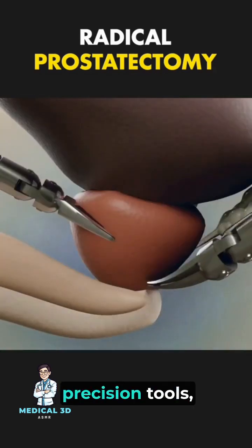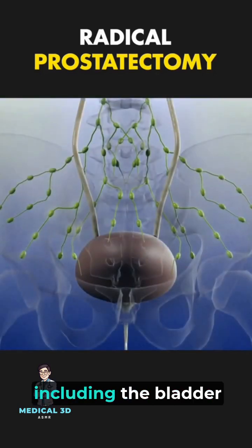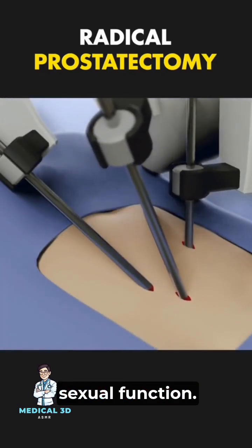Using precision tools, the prostate gland is carefully detached from surrounding structures, including the bladder and urethra, while preserving vital nerves, if possible, to maintain urinary and sexual function.